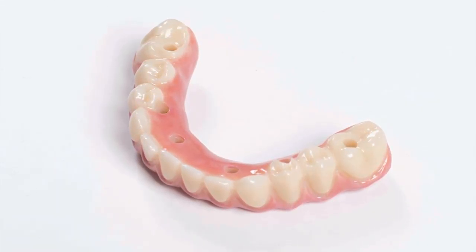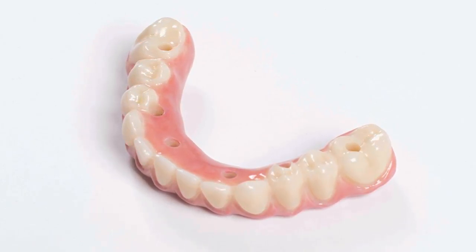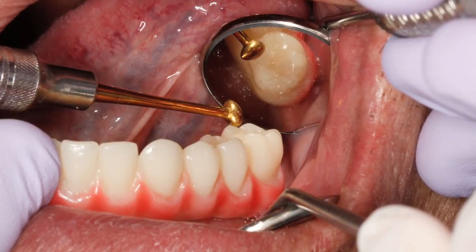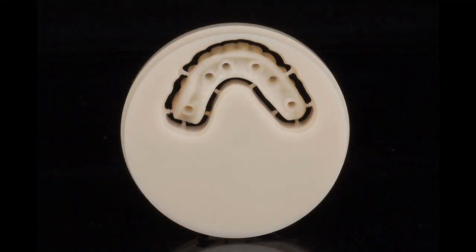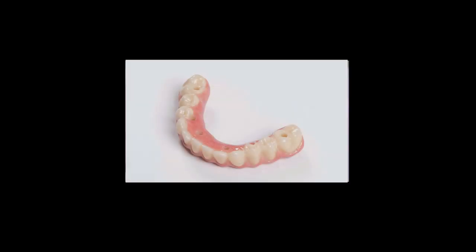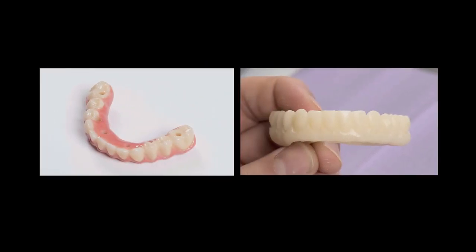Fabricating a full arch prosthesis from Bruxer Solid Zirconia requires significant time, labor, materials and milling capacity. That is why it is important to verify the fit, occlusion, aesthetics and functionality of the provisional appliance milled from polymethylmethacrylate or PMMA. Because the PMMA material can easily be adjusted, it can be scanned and replicated, ensuring that the final prosthesis mirrors the form and function of the temporary appliance.